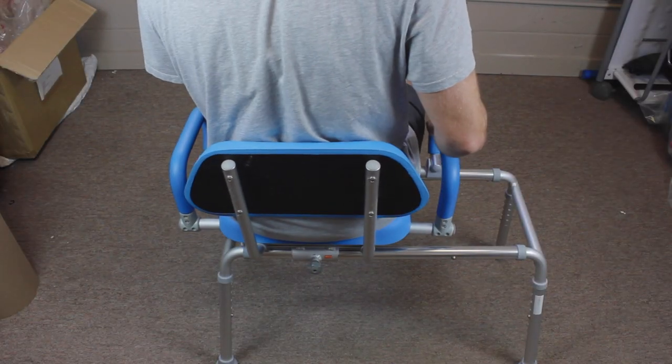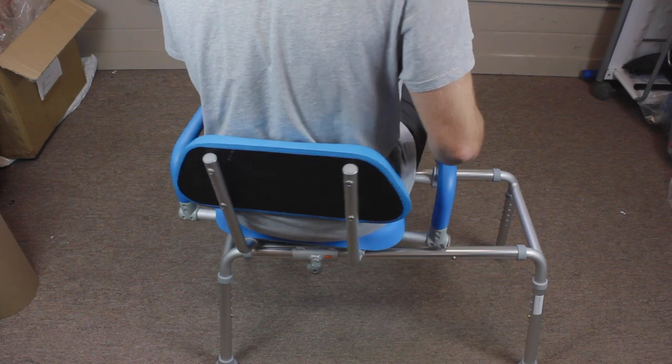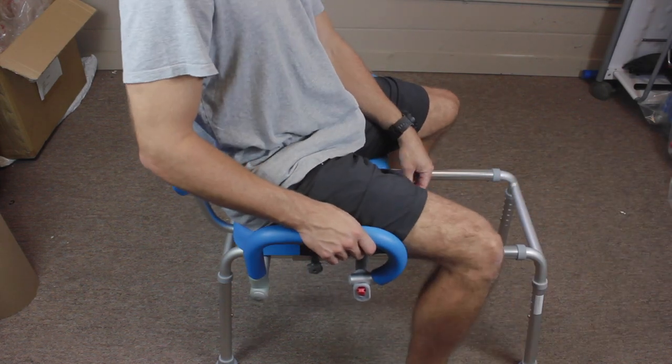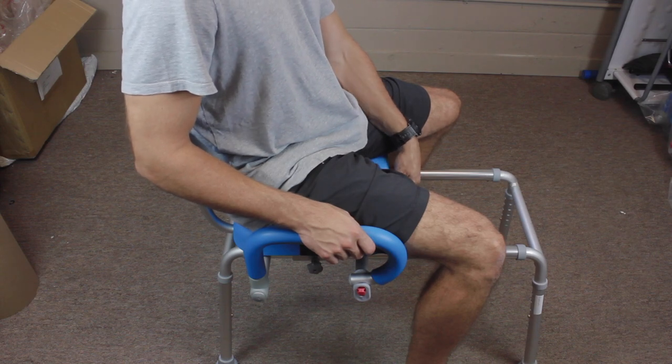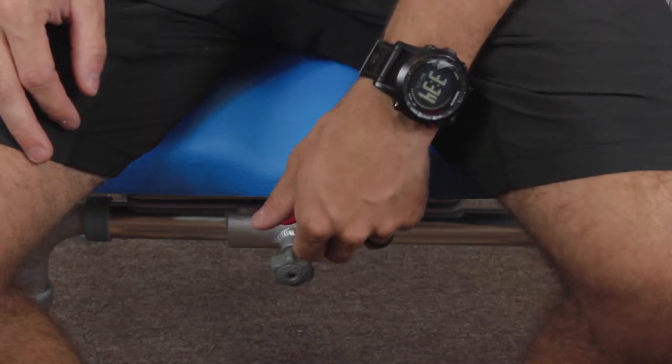When seated and strapped in, you'll want to make sure the chair is locked in either the far left or far right position. Push the red tab to engage the swivel function and slide the chair around the 360 degree axis, locking every 90 degrees.